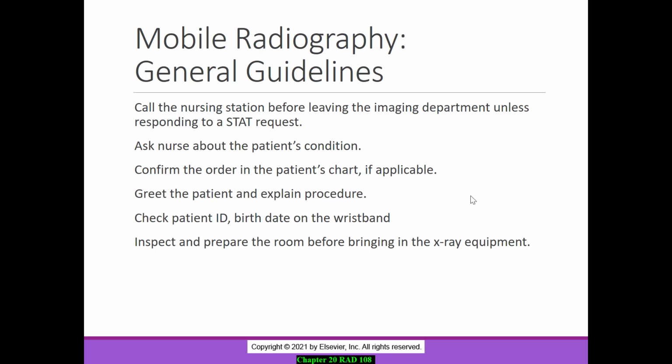So the ones that are posted are in regards to the OEC, which is what you will see at your sites. Our machine is a bit old, and so the locks are the same, but it doesn't have quite the same movements as what the OECs will have. So I do want you to watch those videos so that you're aware of the different movements and what to do when you get into surgery.